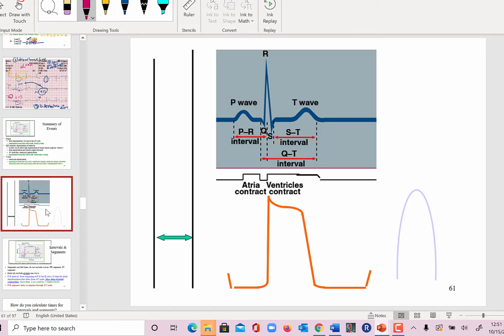It is a comparison of a stationary lead, recording lead vector to the cardiac vectors that are constantly moving as a result of these cardiac events. And the machine obeys simple rules. If the lead vector is parallel to the cardiac vector, the pen will go up. If they are anti-parallel, the pen will go down. If they are perpendicular, the pen will go to baseline.